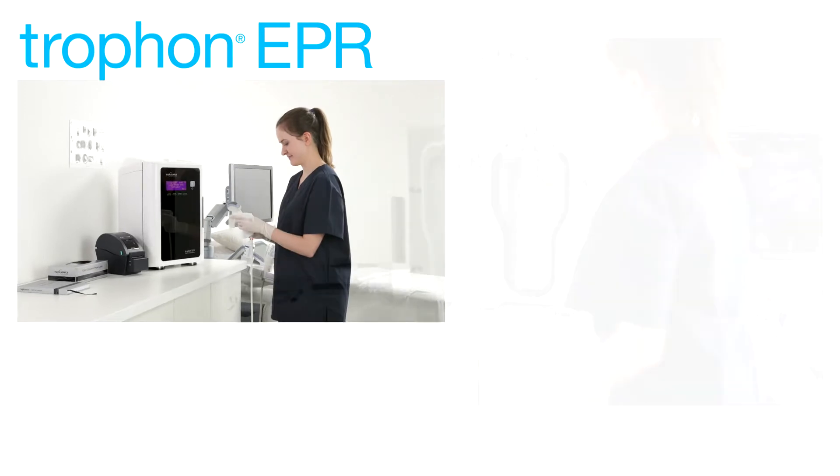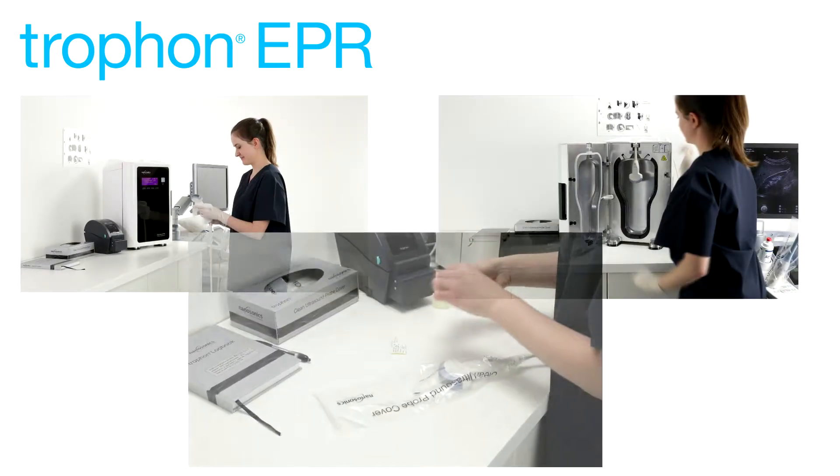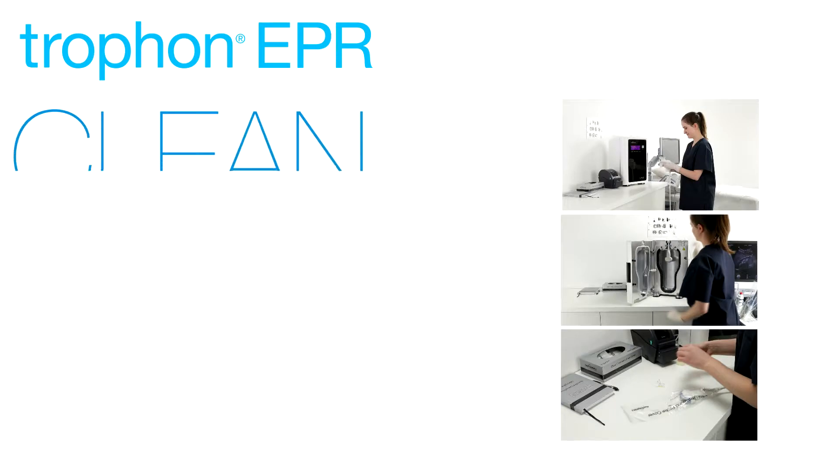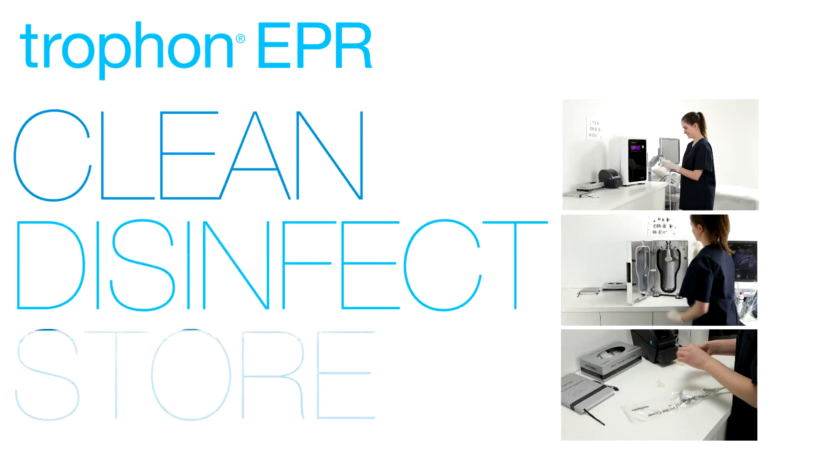This training video will take you through the three simple steps involved in effective ultrasound probe reprocessing: Clean, Disinfect, Store.